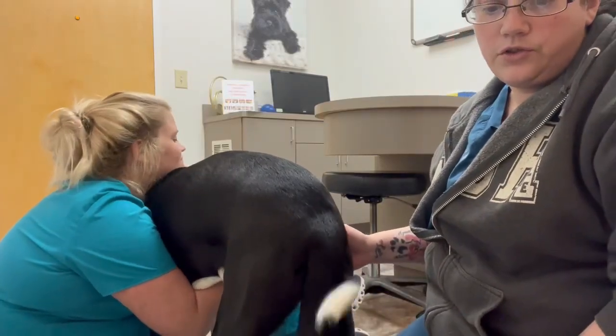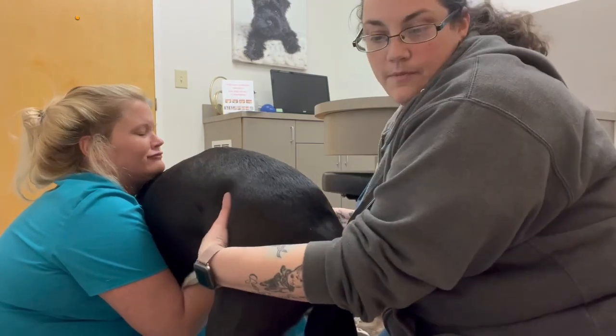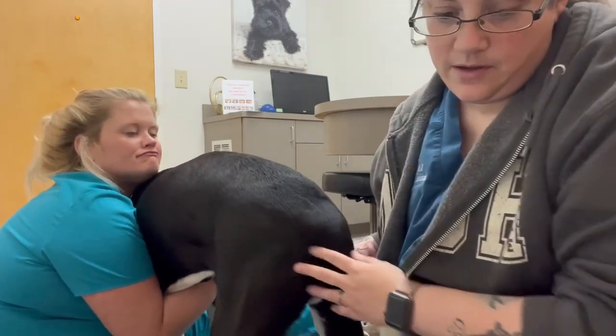This is actually Diluclaine and we are going to do an enema on a small animal. First we're going to palpate, make sure there's no abdominal pain. He's just really tense.